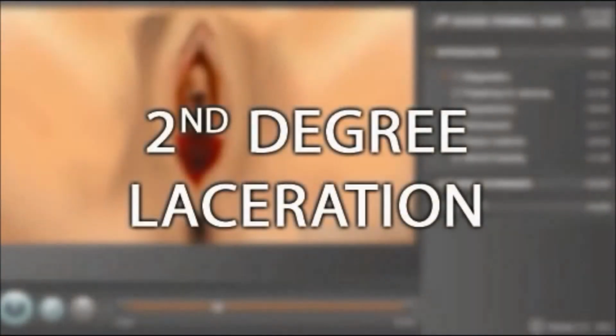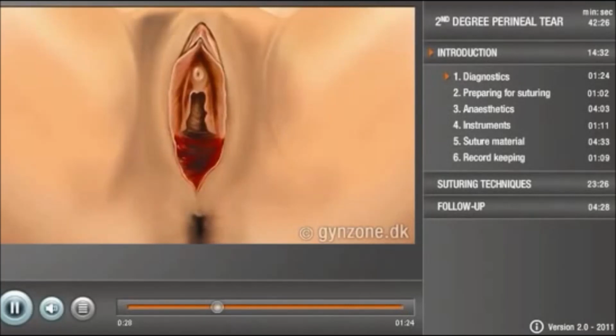We also demonstrate the method of inverted stitches for approximation of the subcutaneous tissue. The suturing of a second-degree laceration can be undertaken using various techniques. The aim is to re-establish the anatomy of the pelvic floor. The chapter is divided into three main sections: introduction, suturing techniques, and follow-up.